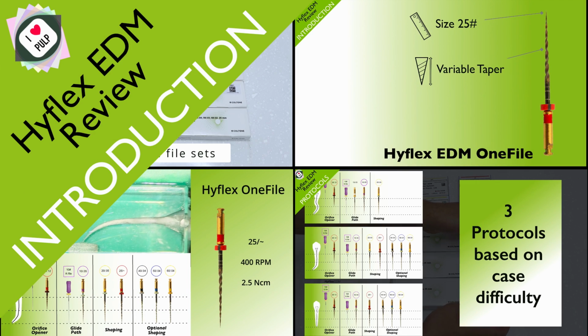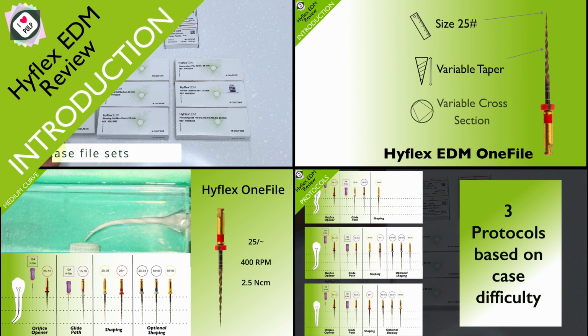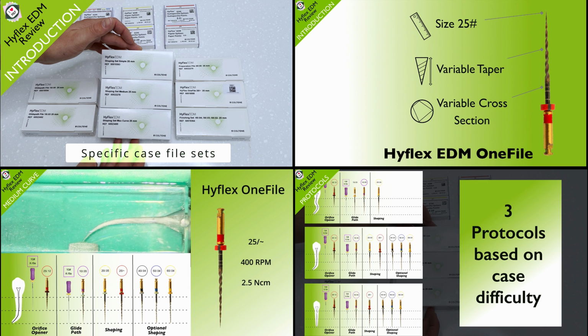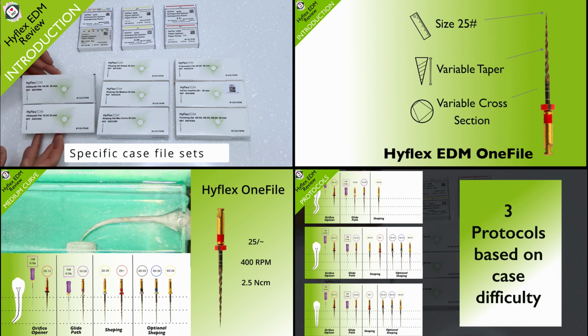Hello and welcome to this fully comprehensive video featuring and reviewing the Hyflex EDM file range. I'll go through the characteristics of the file itself, we'll talk about the full range of products on offer, and importantly, I want to explain the somewhat unusual and unique protocol this file system may use.